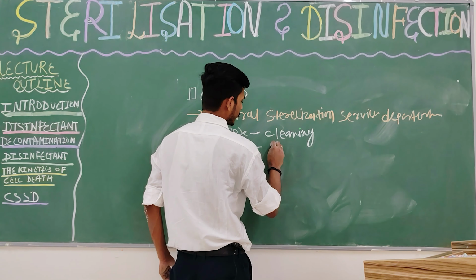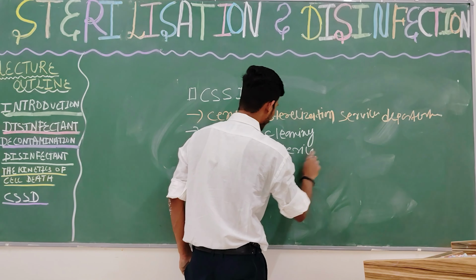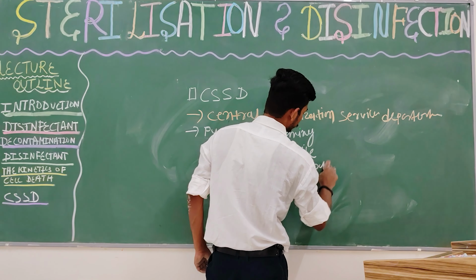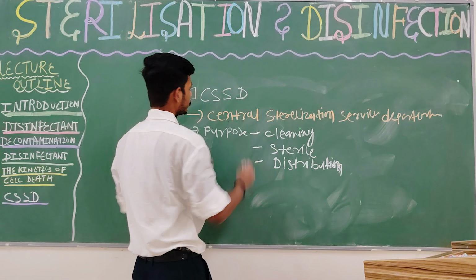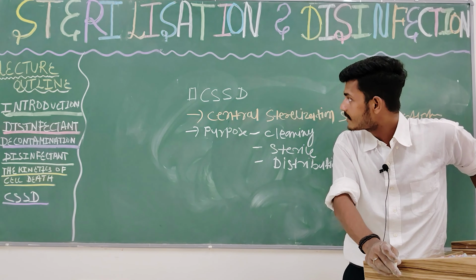So the purpose of this CSSD is, first, cleaning, making equipment sterile, as well as the distribution of sterile products. This is a special department in every healthcare setting, and it is necessary.